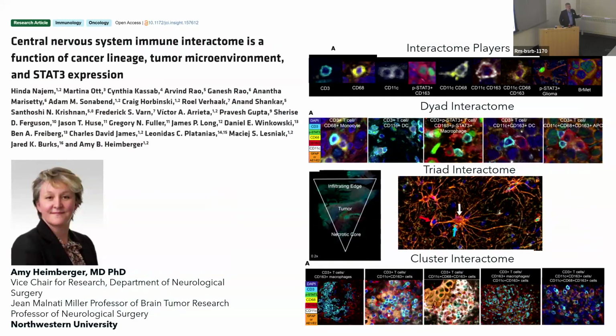Looking at the proteomics and the protein expression is important, but we also want to understand the spatial relationship of all of the cells that we're looking at. And so she's identified, through an 8-plex, the ability to find a variety of different biomarkers related to specific cell types. And what was interesting was that they started noticing co-localization of 2 of those different cell types at a regular frequency.